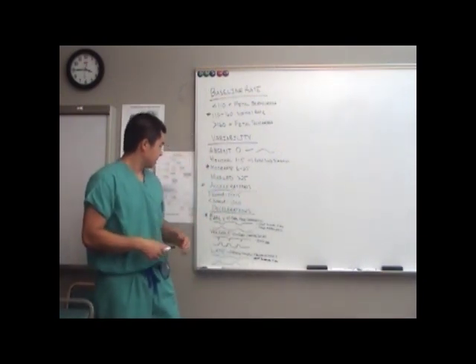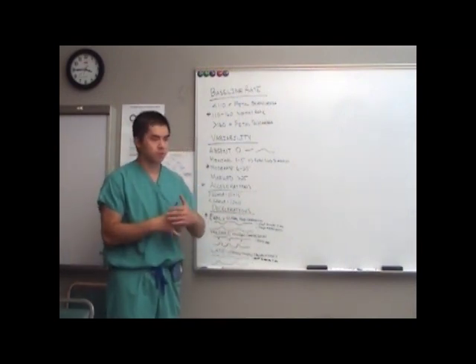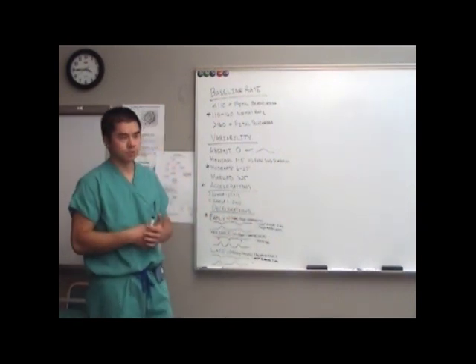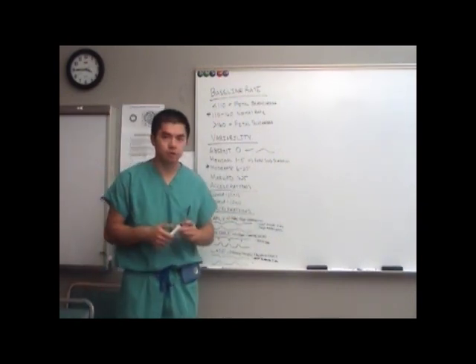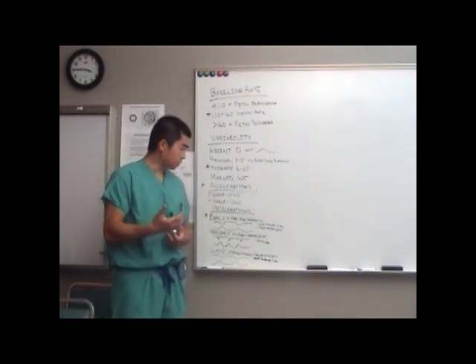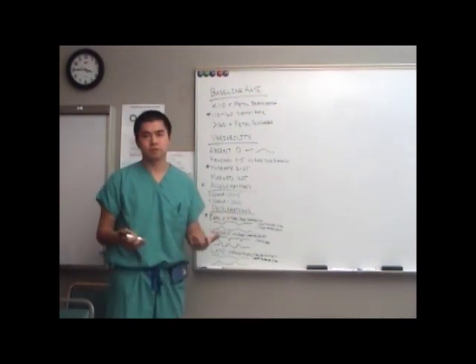Because in the end, there's high inter and intra-observer variation in fetal heart trace interpretation, and it can be frustrating, especially as an intern, but don't let that get to you. Again, another thing you can do is, if you're not sure whether or not to call it an early or late, you can always describe it.